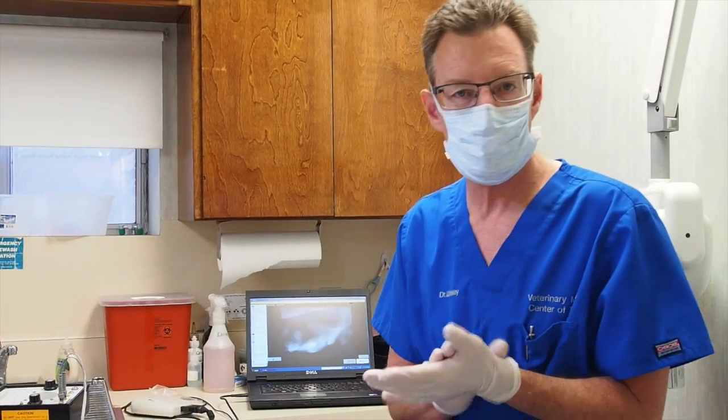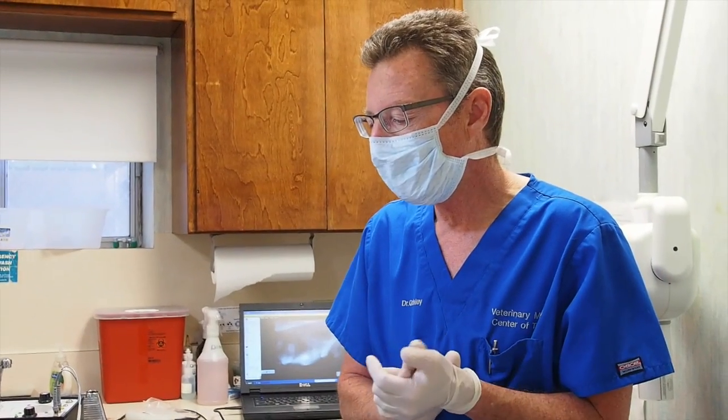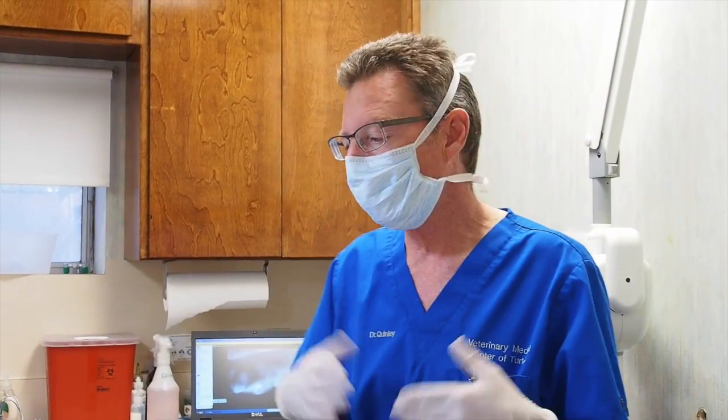It looks like the pulp is exposed, so we may have to go and address that, and that's the basic dental that we do on dogs. Obviously it's done under anesthesia. The main reason is we can't clean up under the gum line, we can't take x-rays, we can't probe for pockets, and we can't polish.